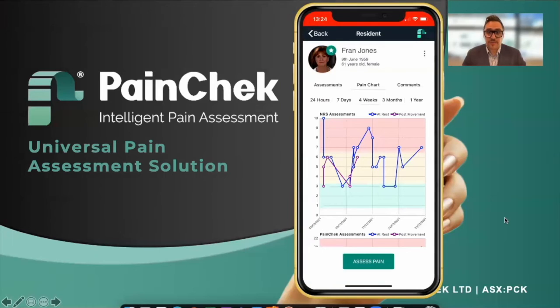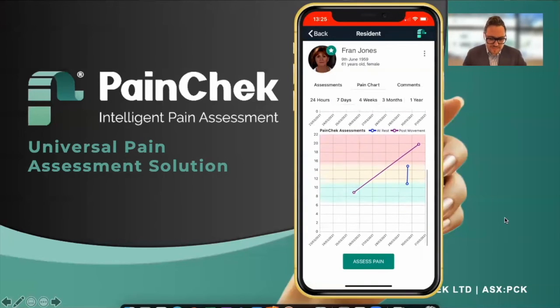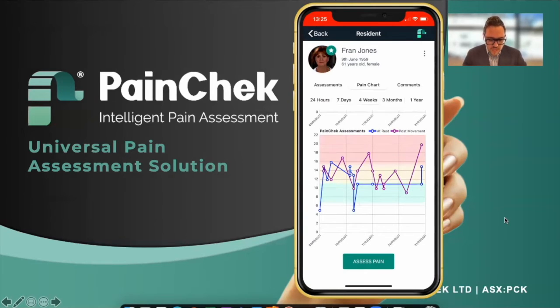So right now for Fran, we're looking at her last 4 weeks. You can see we can select different durations there to look at on our chart. 7 days, significantly fewer assessments over the last week for Fran. And we can see up top her numerical rating scale outcomes broken into at rest or post movement, the 2 colored lines there. And we can see her PainChek pain assessments. So once again, looking at 7 days here or the last week. Pretty up and down for poor Fran, though hopefully your residents in the real world have somewhat smoother experiences.